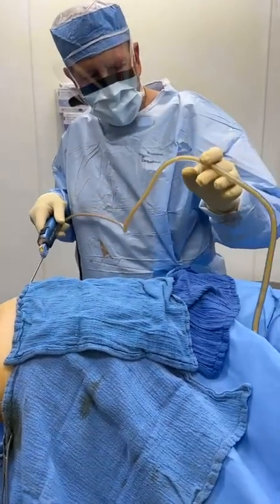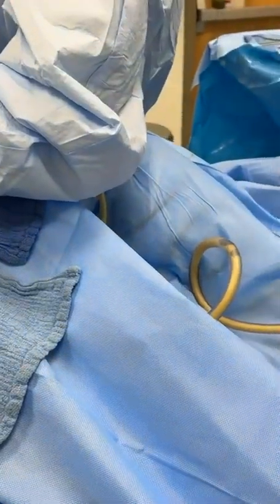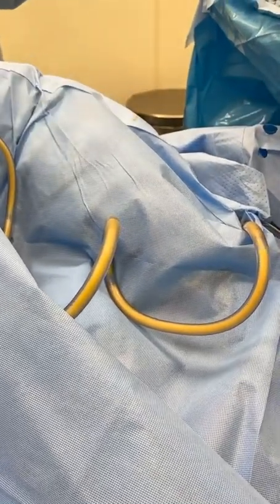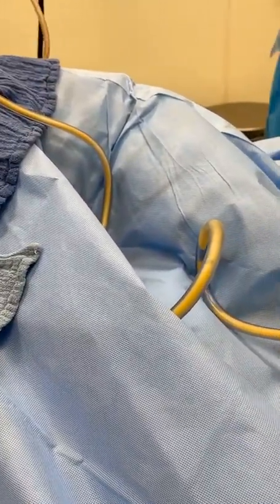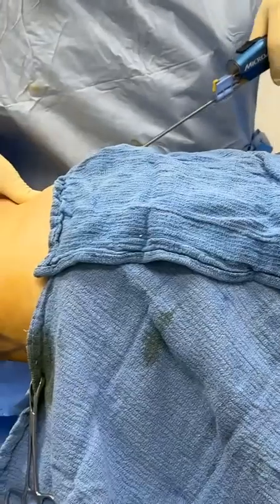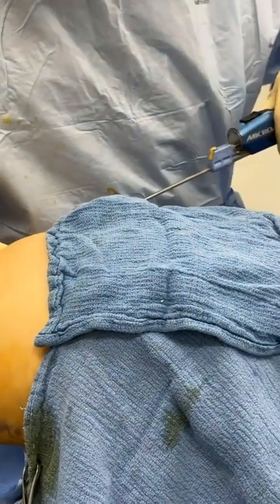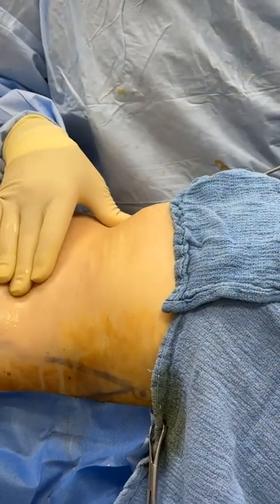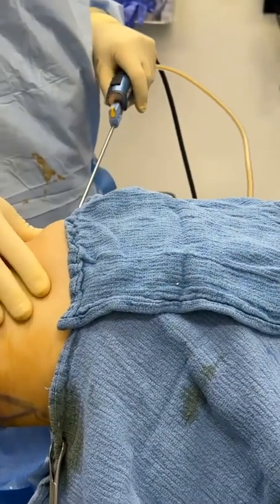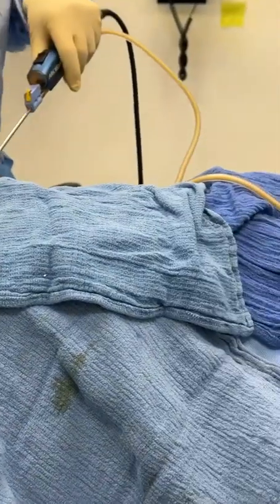But to obtain this yellow, beautiful aspirate consistently, all the time, all our patients get this output, right? It's not just one or two, it's all of them. And this is incredible, because this is what's gonna go into her buttocks. It doesn't need to be treated in any way, so we don't spend the time processing the fat. You can go very fast here, but then what comes out is all red, then you gotta treat the fat. There are companies that sell you systems to clean the fat, and we don't need it.